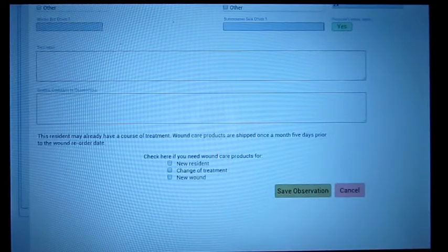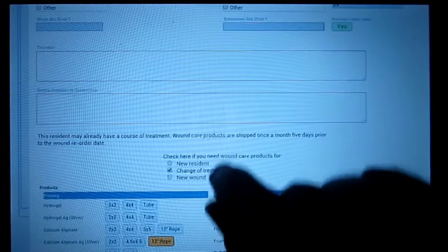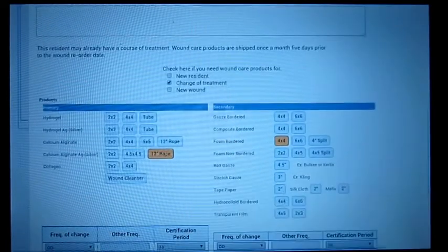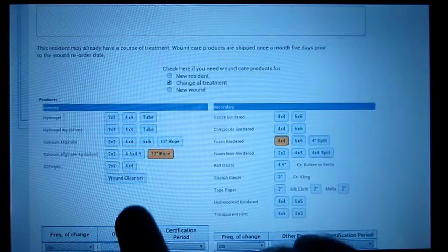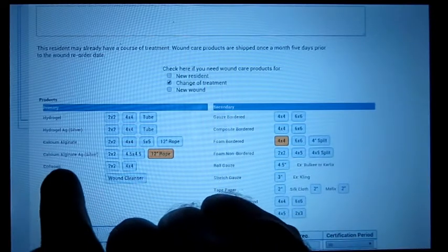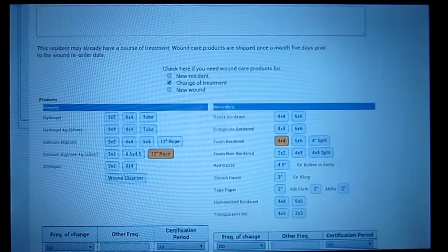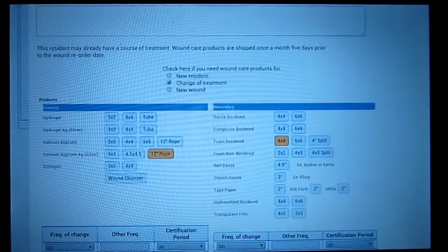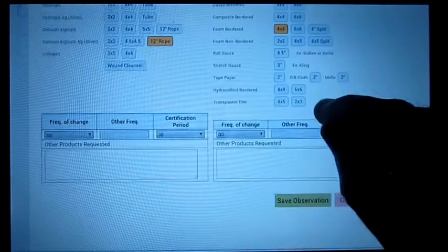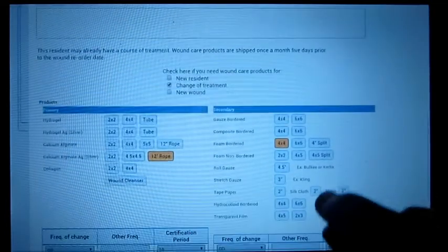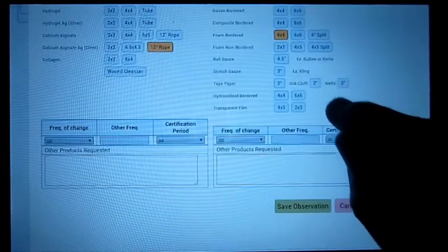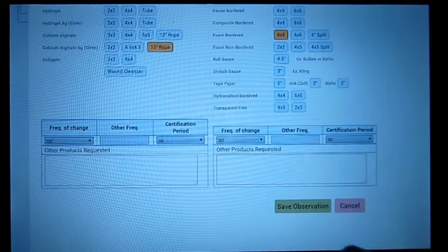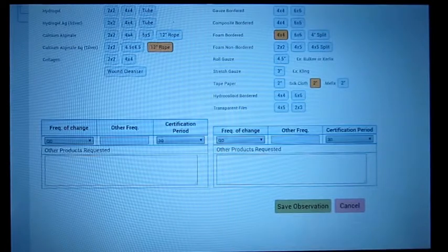If I hit change of treatment, up comes the products. We actually have some new products in here too. We've changed some of the others. We have a new calcium alginate silver 12-inch rope coming in and we have a 5x5 calcium alginate. We've simplified the product ordering here. If you wanted to order, you would tap on what you want and then say Save Observation.